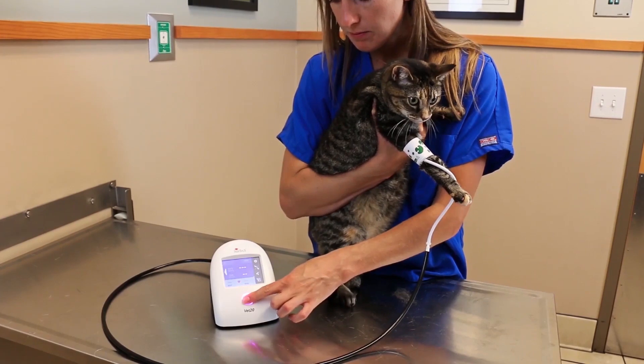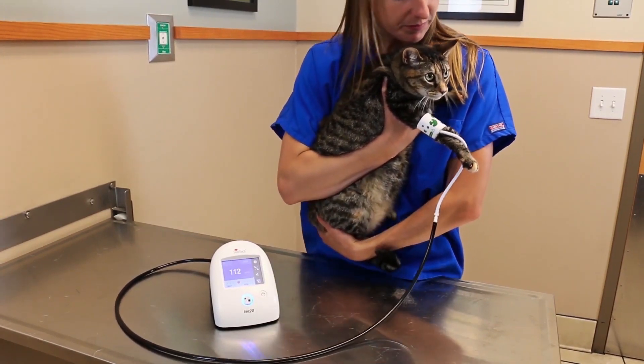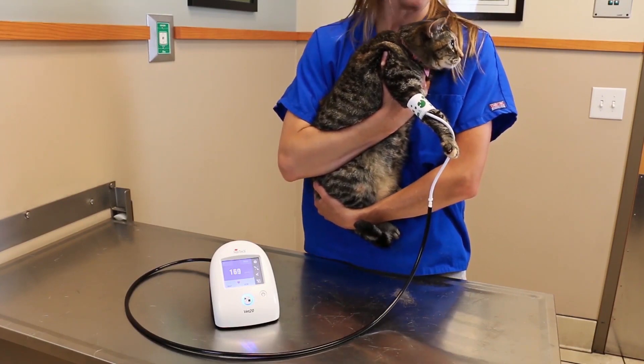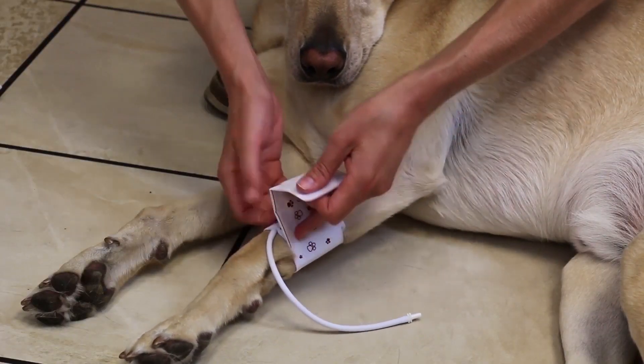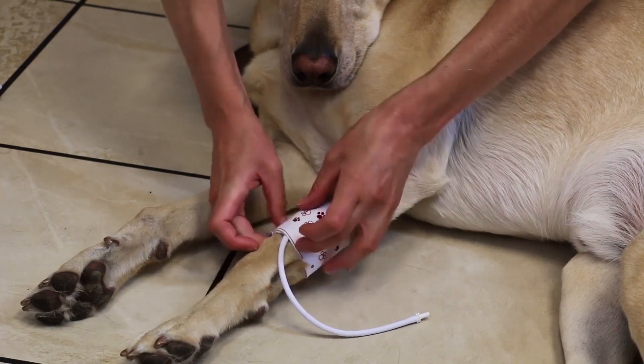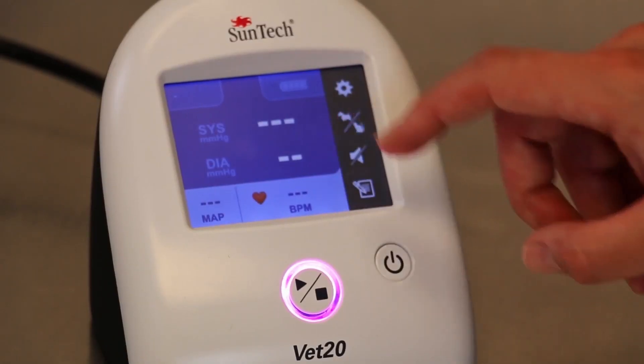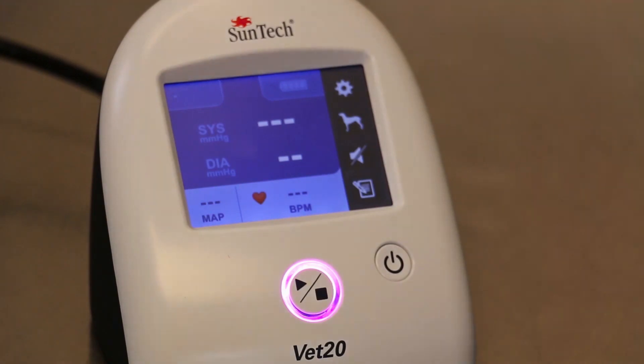Small animal mode should be chosen when taking BP measurements on cats and dogs up to a number 3 cuff size. Large animal mode has been designed for animals requiring a number 4 BP cuff or larger. If you need to switch modes from the main screen, just press the animal size button.